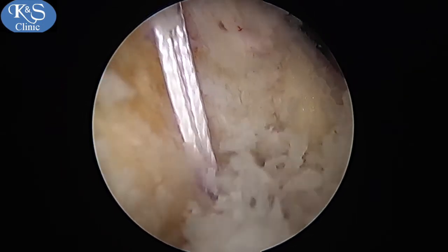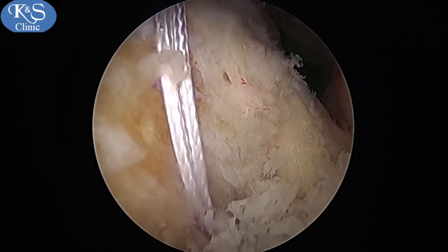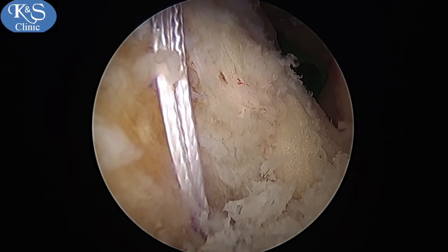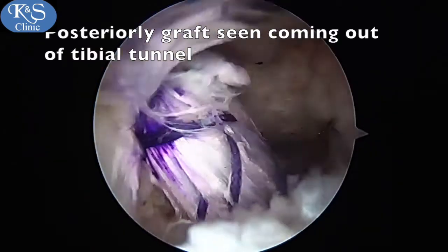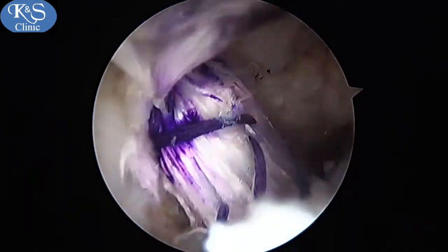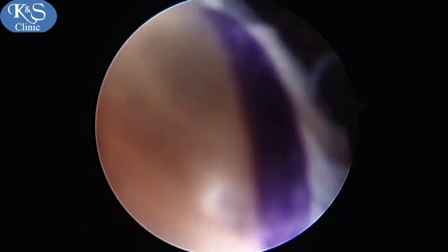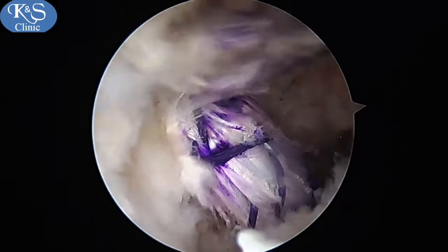That is the advantage of this approach — you get a good end-on view of the posterior end of the tibia and can actually see your graft coming through the tunnel easily as it is milked up. The PCL can now be seen moving up the tibial tunnel into the femoral tunnel as it is milked up gradually.